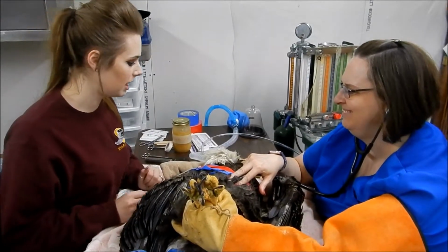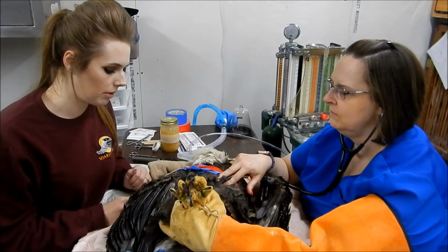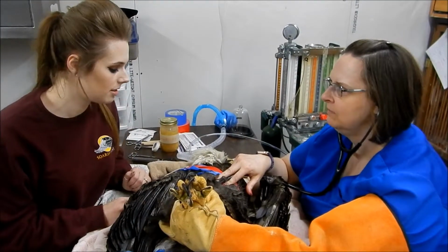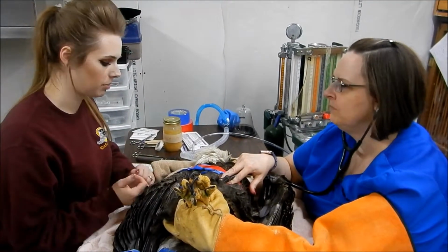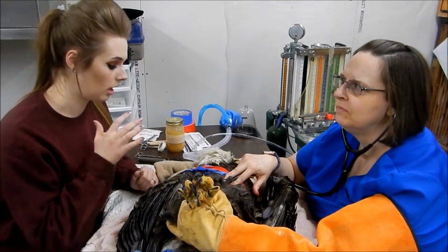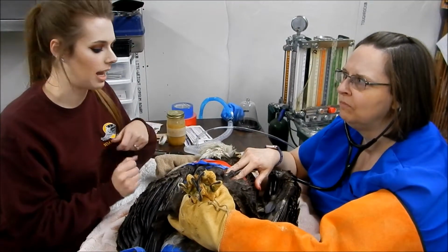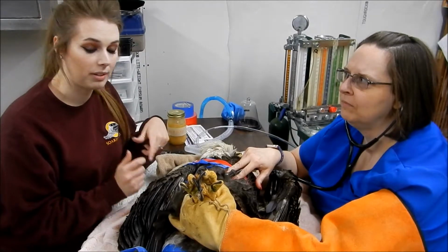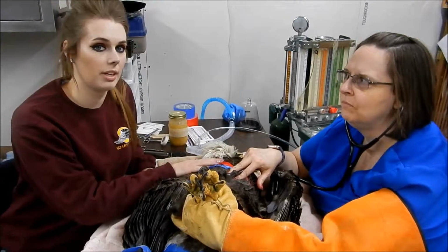Okay. So today we are going to be doing physical therapy on this eagle. We are also going to be cleaning around the IM pins where he fractured his humerus. So the first thing we're going to do is we're just going to cut some of his bandage off so we can actually look and see what the pins look like. We're going to take off all the bandaging and we're going to clean around it and then put everything back together. And before we put the wing wrap back on, we are going to do physical therapy.